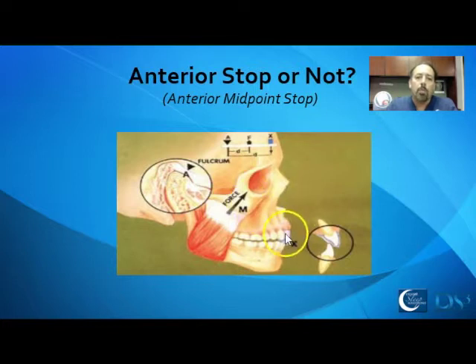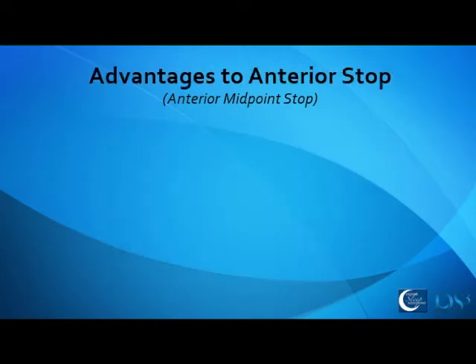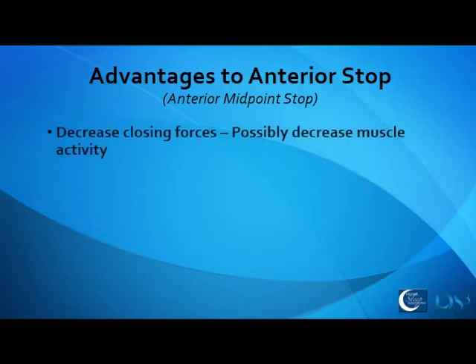We do know that we will put less force because the pivot point is further away from the rotating axis. That much is true. Whether it decreases muscle activity or not, we could debate, but I've only got about 5 minutes to do this video, so we won't debate that today. So we'll get right into why you might do this and may not, and what the advantages of this anterior stop are and the disadvantages.